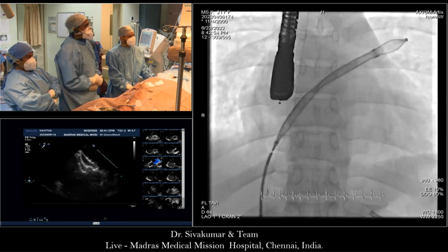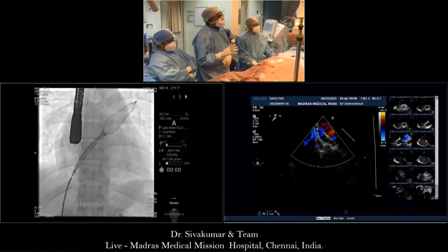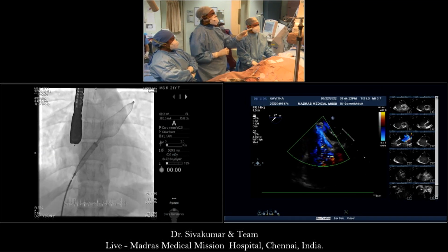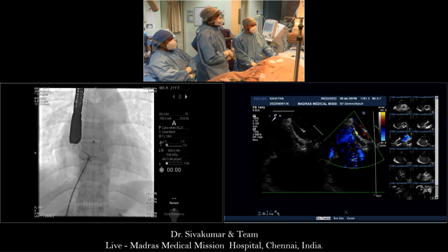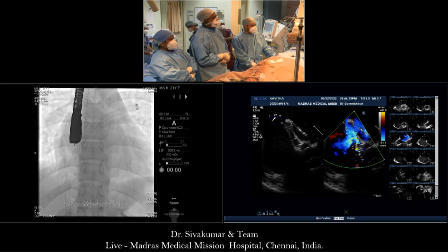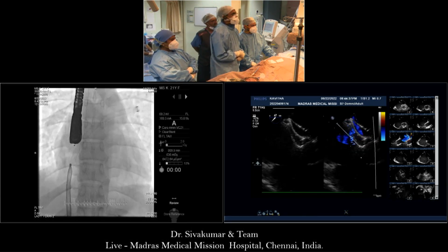No, color it. This sort of undersizing is very risky, and these are all recipes for disaster. Correct. Show Zahid the mitral valve before you ask. Absolutely, that's an absolute contraindication. In fact, it's not whole. There is color across all the edges. It's just simple.